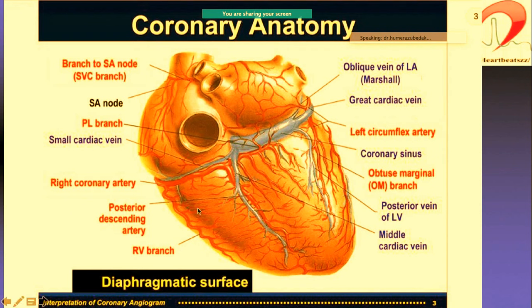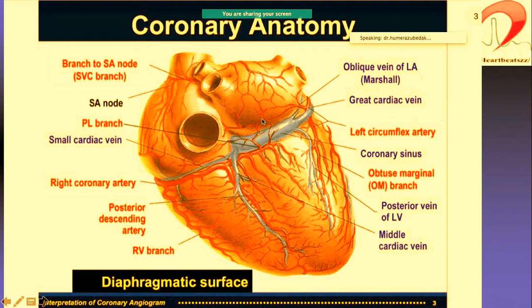This is the diaphragmatic view — looking at the heart from below. You can see the great cardiac vein and the branches of the coronary sinus. The coronary sinus is the one targeted in cardiac resynchronization therapy — CRT-D or CRT-P — with further sub-branches of the coronary sinus being the targets.